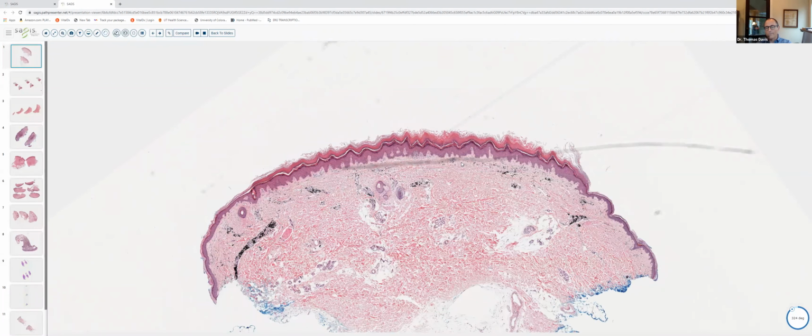So we're fairly deep. And then we've got this big nodule here of histiocytes, most of them multinucleated. So we've got a big granuloma. And within the central portion of the histiocytes, we have this translucent particulate material that has kind of a spiky appearance.